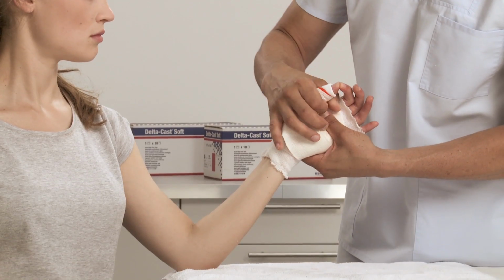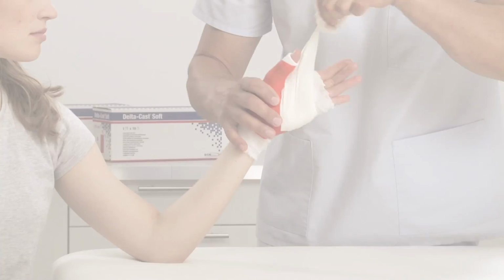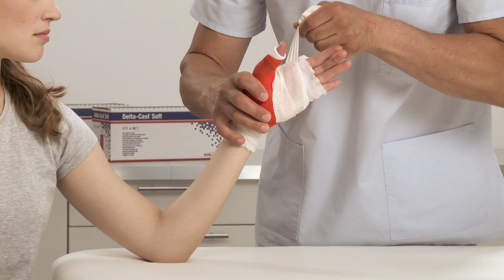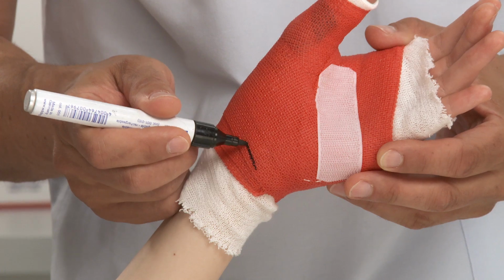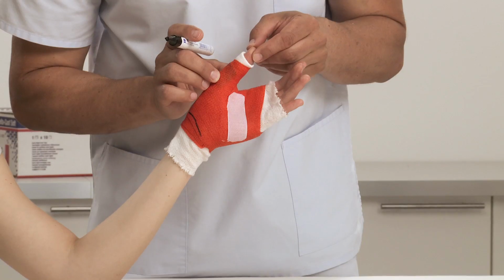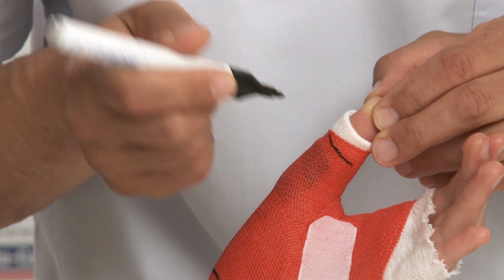Mold cast with the palm of your hands and check for desired range of motion and any pressure points. Keep the bandage in the limb position for around 5 minutes until the cast is set. Then remove the bandage. Use a marker to draw desired cut lines on the cast.